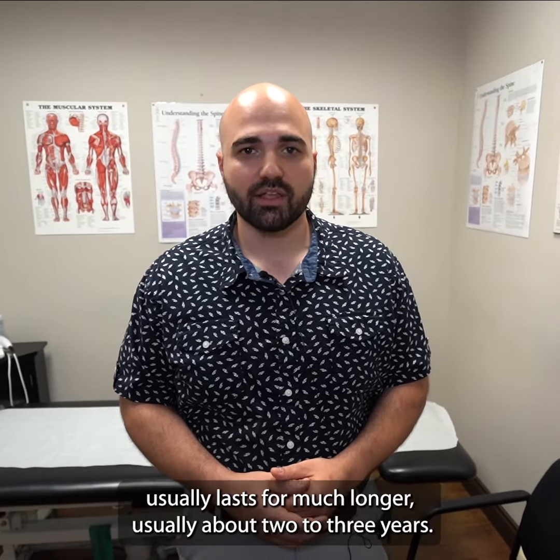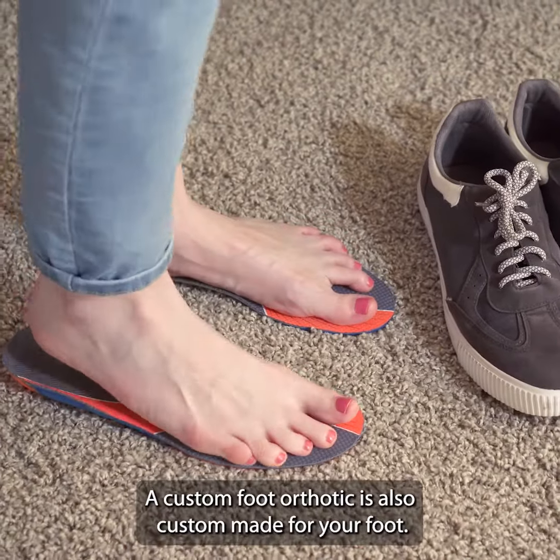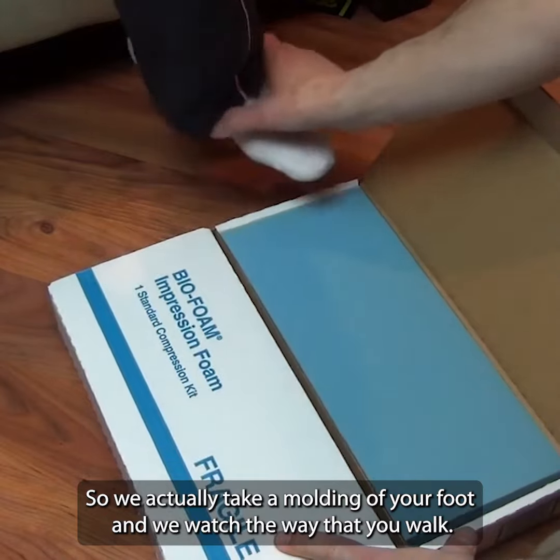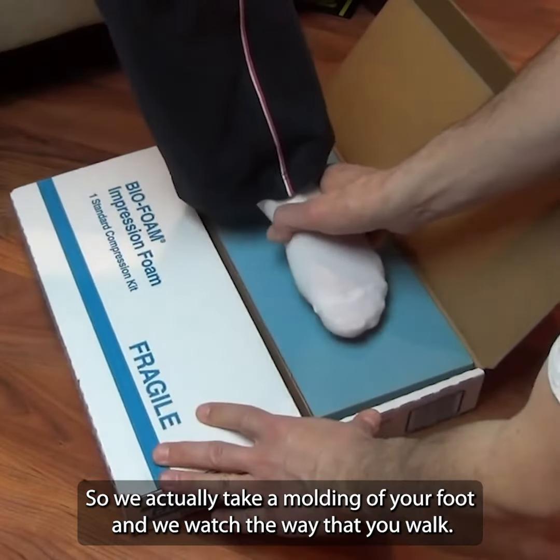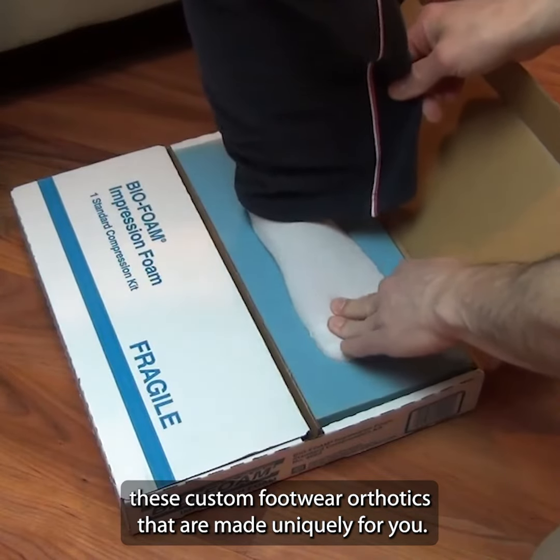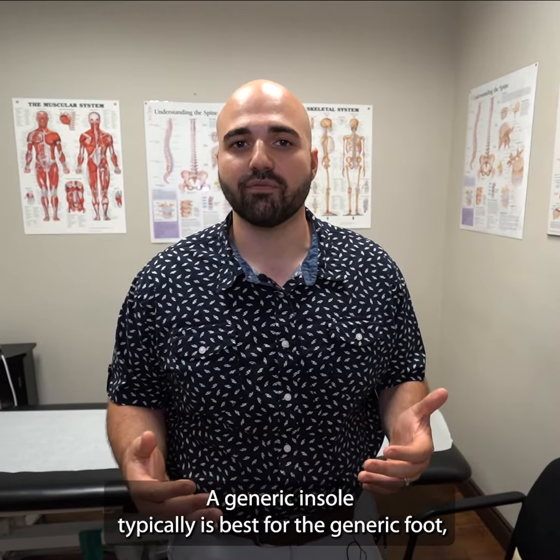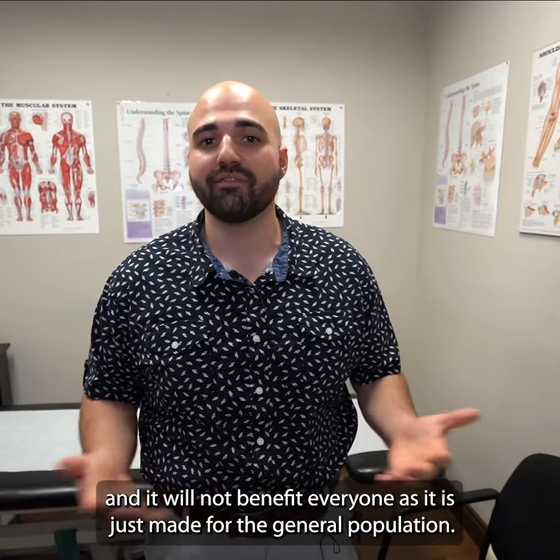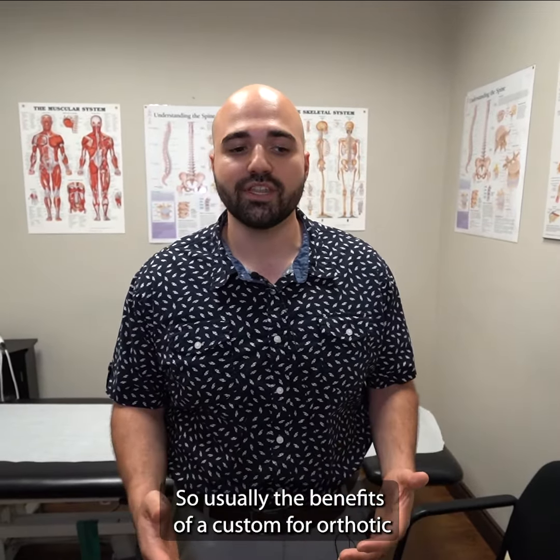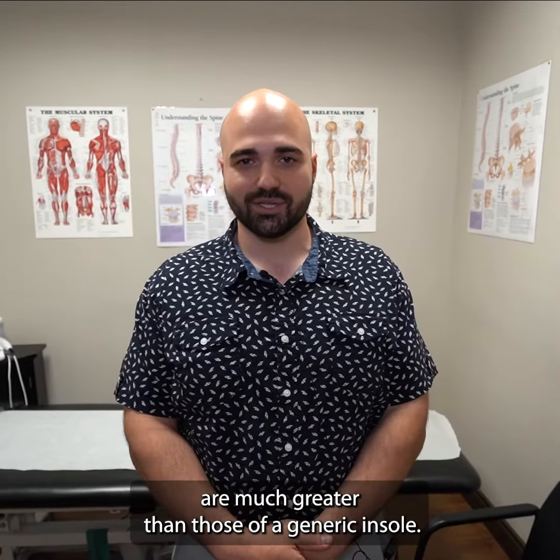Well, typically generic insoles are much less expensive than a custom foot orthotic, but there are many differences. A custom foot orthotic usually lasts much longer — about two to three years. It's also custom-made for your foot; we take a molding of your foot, watch the way you walk, do an assessment, and send these to a special lab where they fabricate orthotics made uniquely for you. A generic insole is made for the general population, so the benefits of a custom foot orthotic are usually much greater.